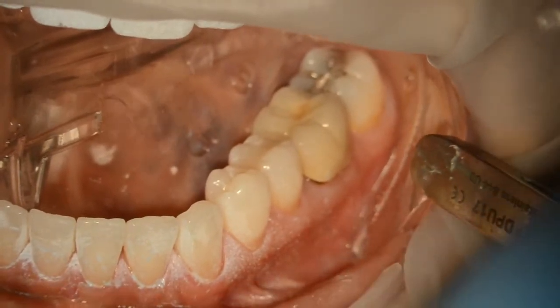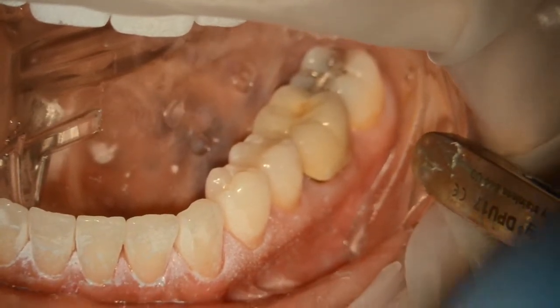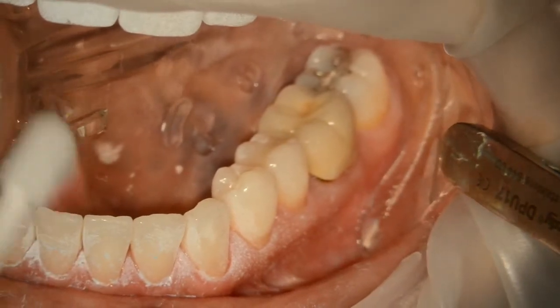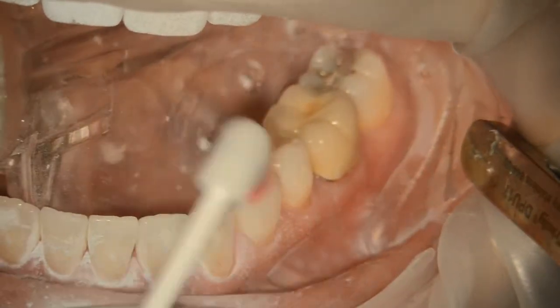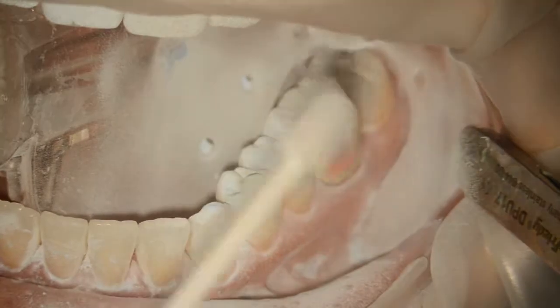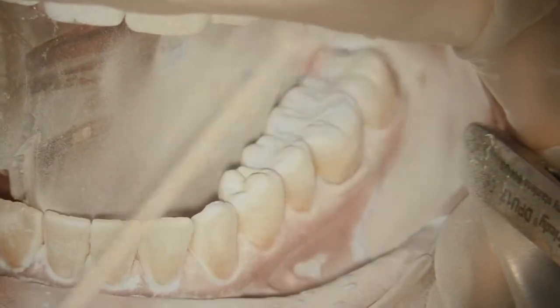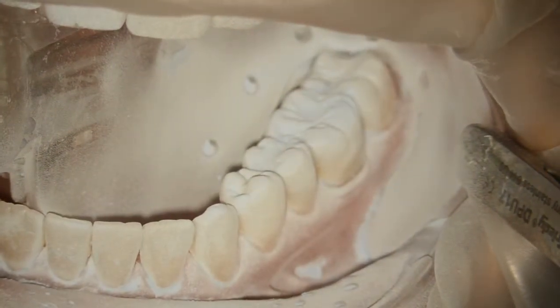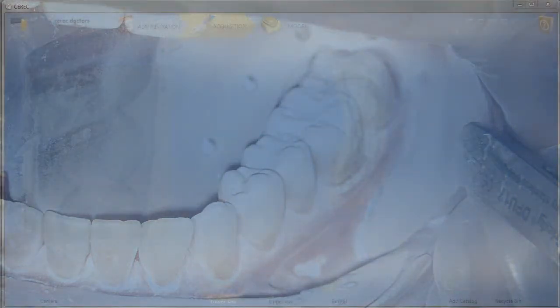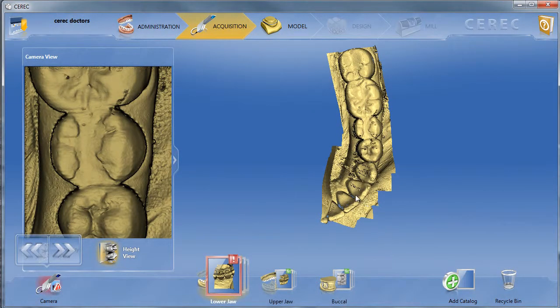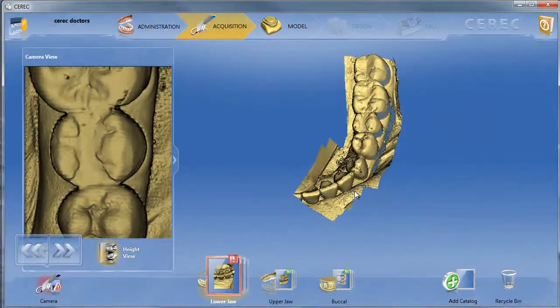Then we'll go ahead and place the Isolite and retract the tongue and retract the lips for easy access. We're going to capture images from the second molar all the way to about the right lateral, even the right canine, the lower canine. You need very good landmarks all the way to the canine so they can relate this left part of the quadrant to the right part of the quadrant.